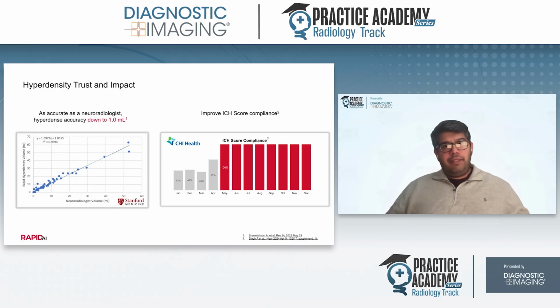Part of that is things like GCS. Then they also really care about hematomas and whether or not they're about 30 milliliters or more. And that's part of the score that goes into the patient system. So not only do you have to give a volume in order to get the score, you have to be fairly accurate with it, whether it's about 30 cc's or less than that. So getting an automated volume that can be used by the team tracking these scores can drastically help improve compliance with the Joint Commission requirements.